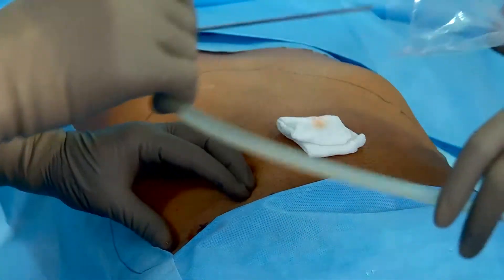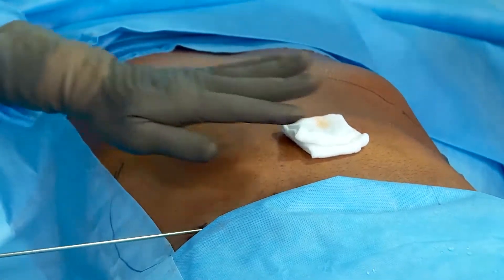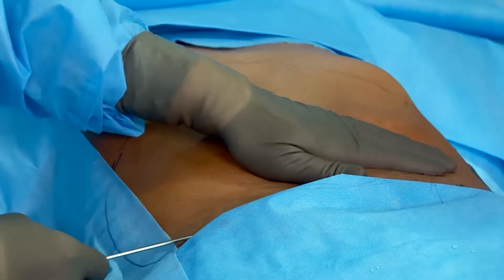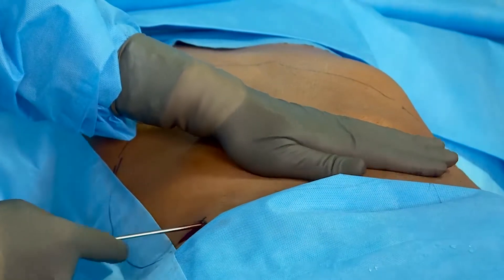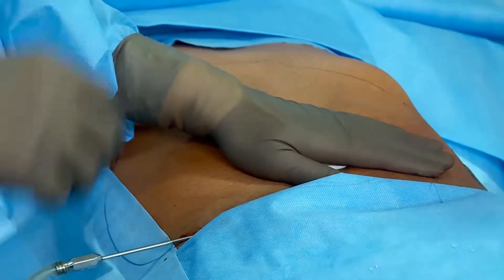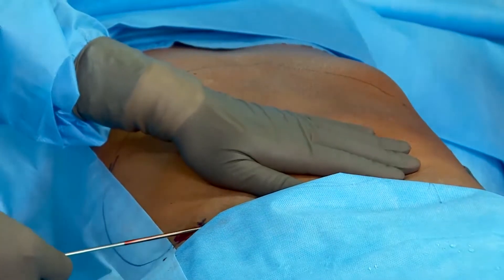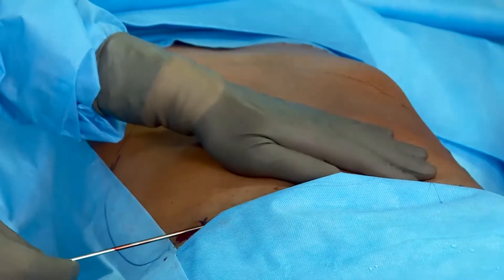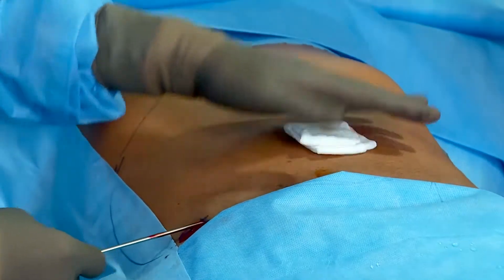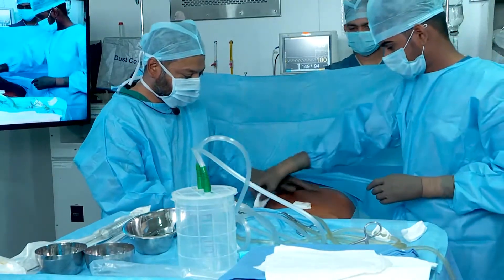After giving local anesthesia, we will infiltrate it. The patient is under local anesthesia only — not sedated or given any kind of spinal anesthesia. With this infiltration cannula, we have started infiltrating the fluid into the abdomen.